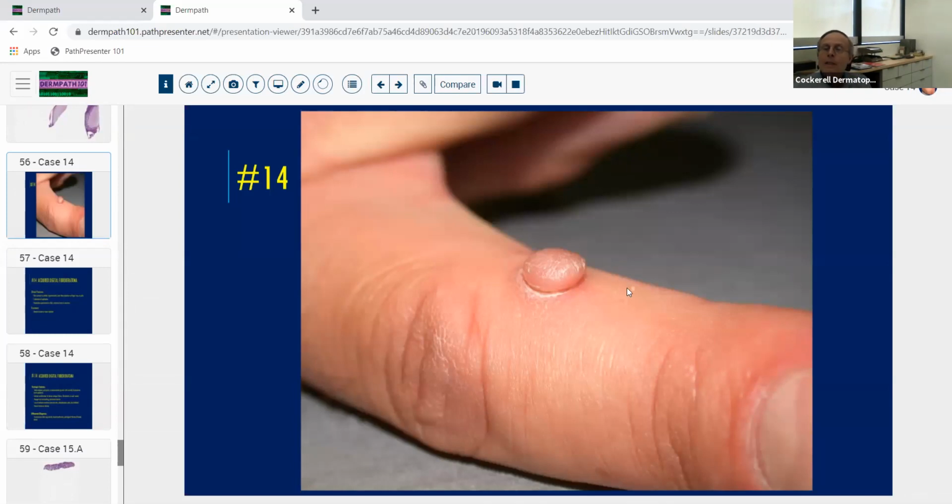And when they do, the differential diagnosis of those becomes the angiofibromas associated with tuberous sclerosis. So make sure that you know the difference between those lesions and this lesion. Those generally have a more myxoid stroma. They have many more blood vessels in them. They don't really have quite the thick fibrotic fascicles of spindle cells that interweave that you see with acquired digital fibrokeratoma. But this is what they look like.